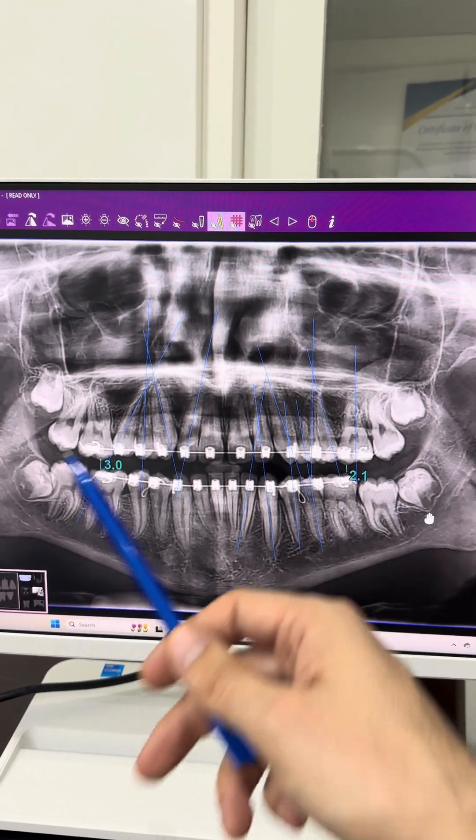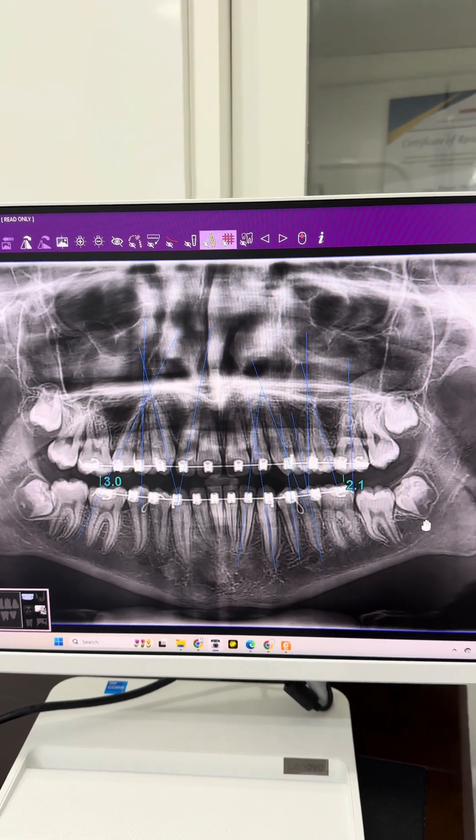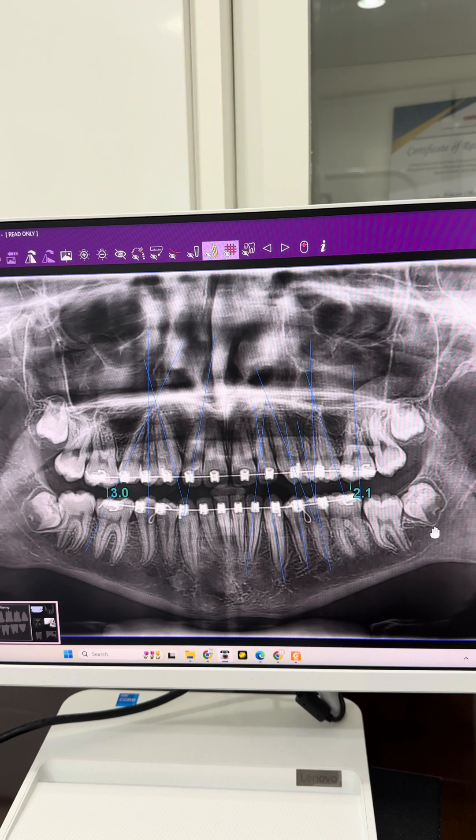This patient has braces placed in Germany and came to continue the treatment. His doctor told him that he needs only a few months to remove the braces.